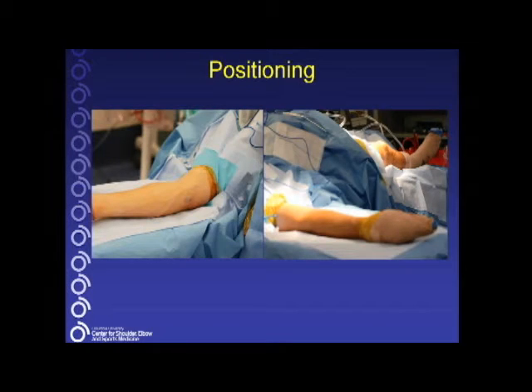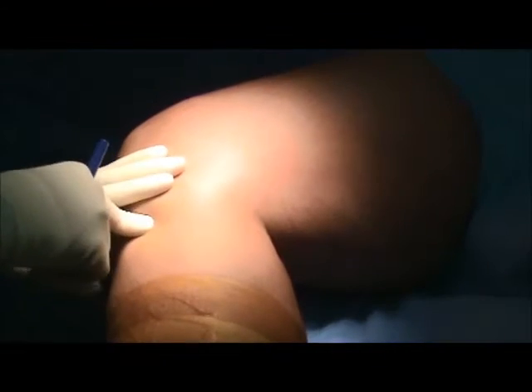Here the patient is positioned. Both the leg and the arm are prepped and draped. This patient did not have a palmaris longus graft, so the gracilis tendon will be harvested. Non-sterile tourniquets are placed on both the upper and lower extremity. We choose to use the ipsilateral lower leg for the graft harvest.